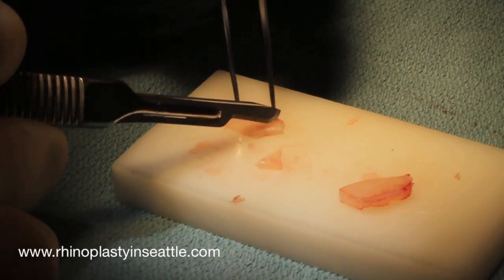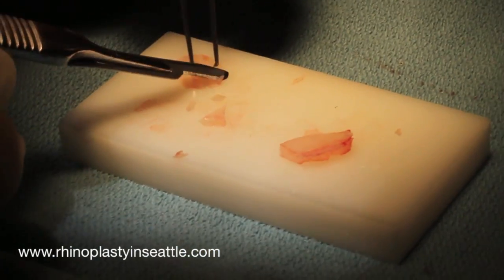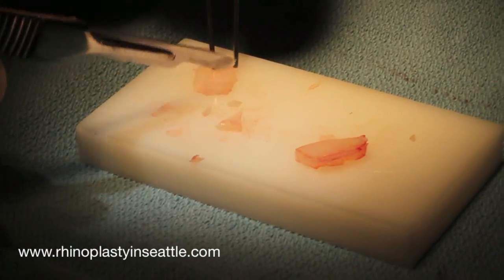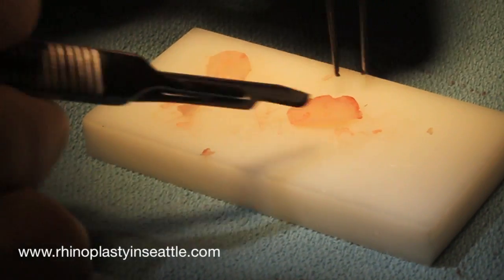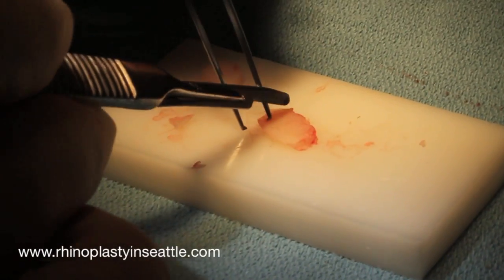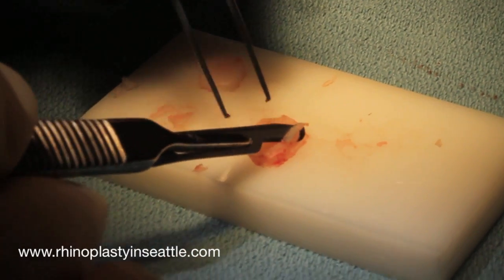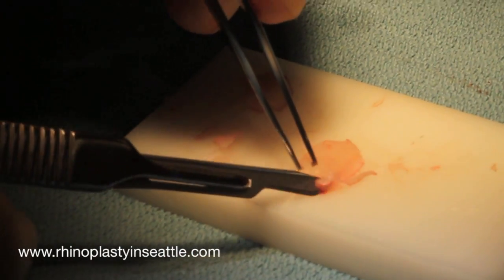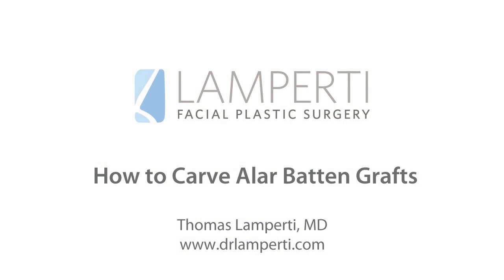You can see that I've moved on to carving the second graft, where I'm creating a similar type of beveled appearance. You can see how the grafts are oval shaped to roughly translate to the area of the external valve. Once I've fine-tuned the edges and beveled some more, you can see how we can shave the corners off of the graft to smooth and make the transition quite natural before inserting them.